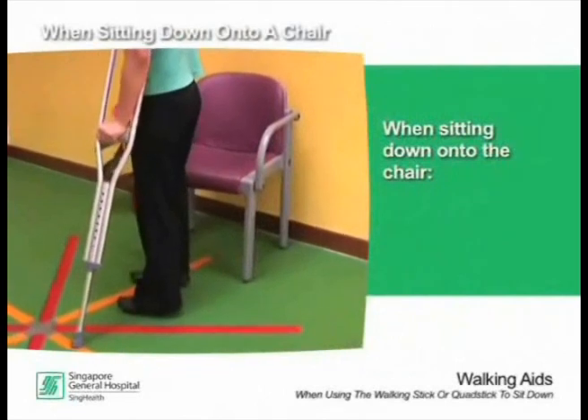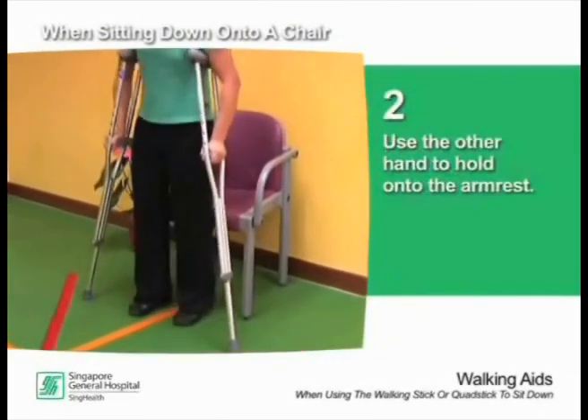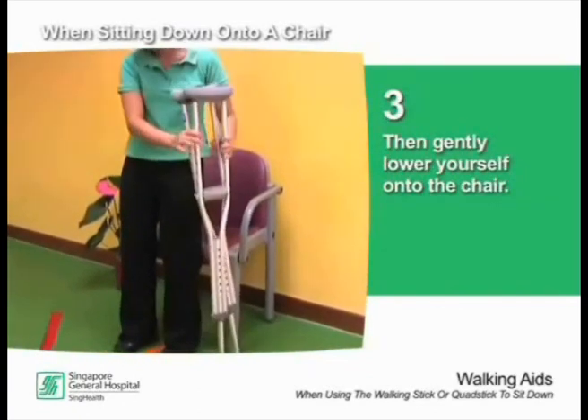When sitting down onto the chair, place your crutches or stick to your side. Use the other hand to hold on to the armrest. Then gently lower yourself onto the chair.